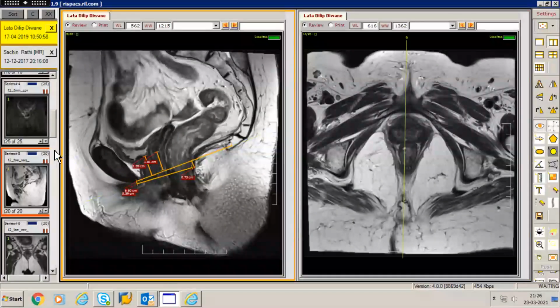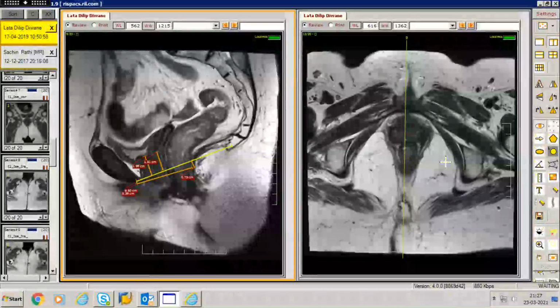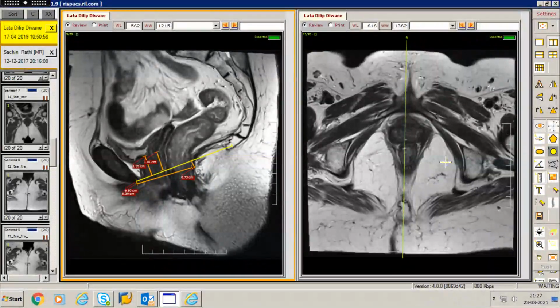Okay, so just to add on to that, if you're looking at the axial images, which Dr. Swaroop has put on the right of your screen, the typical hiatus is a diamond-shaped configuration, or a rhomboid, whatever you want to call it. So the upper two edges are very short and shallow, whereas the posterior edges, the lateral margins here, are a little longer and more acute in their angulation.